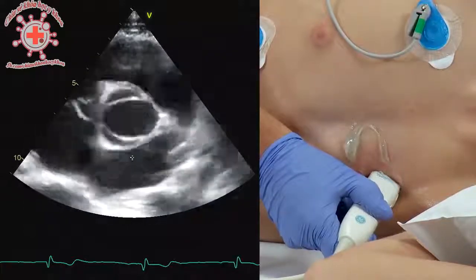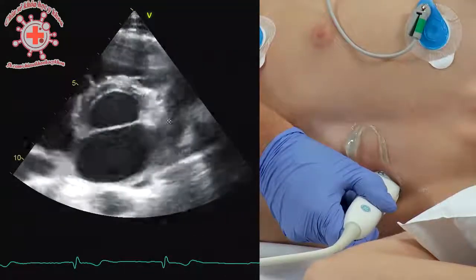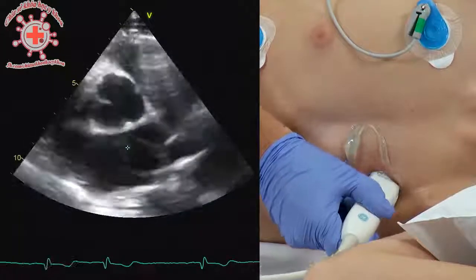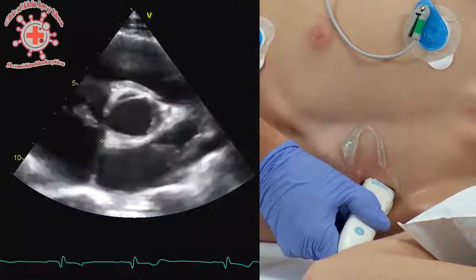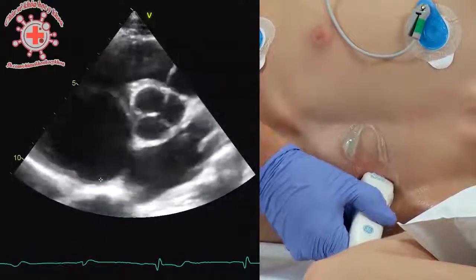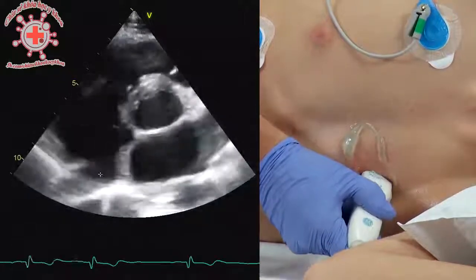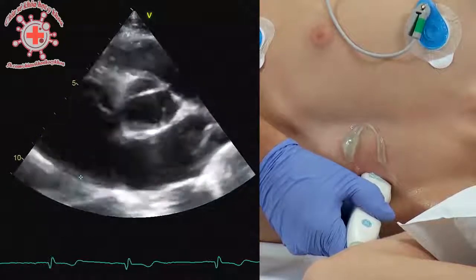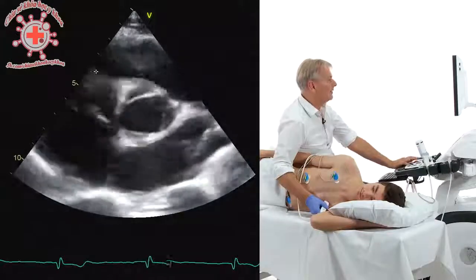Now showing you the other structures — you see this is the left atrium. If you tilt the transducer a little bit more caudal, you can see the left atrial appendage here. And if you move the transducer back, it's very nice to identify the intra-atrial septum. If you turn to the right atrium and move the transducer a little bit more, focusing on the right atrium, you can also see the IVC as it enters the right atrium.